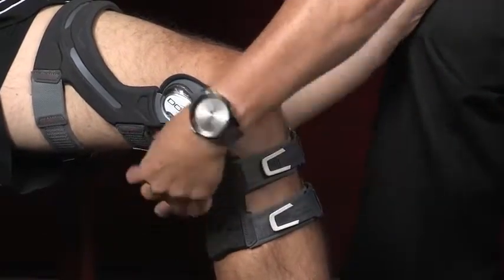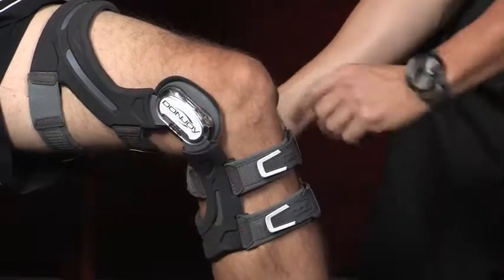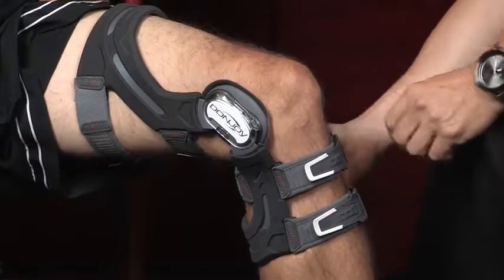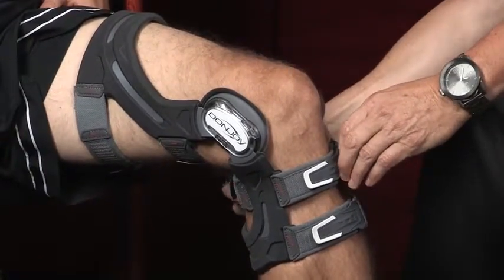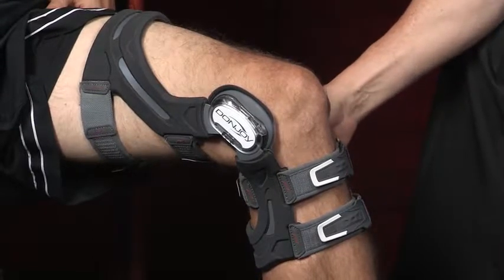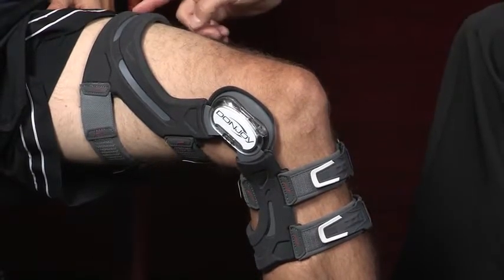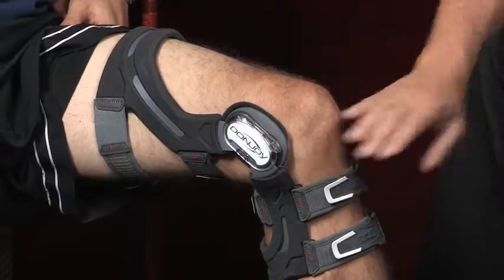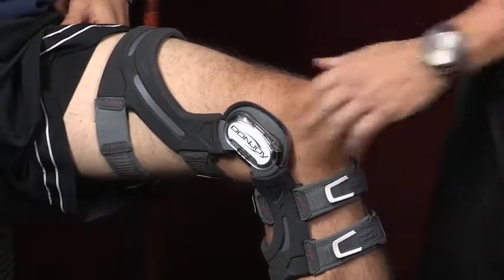Your number five strap is right behind your calf. One suggestion here that works really well — once you've put this brace on the first time, you probably do not have to disengage this strap a second or third time. That's pretty much set each time. So every time you put the brace on, straps one, two, three, and four are the ones you're going to adjust every time, based upon your level of activity.